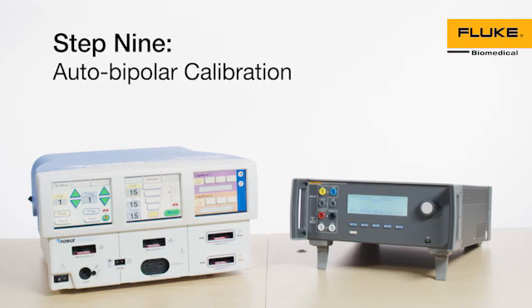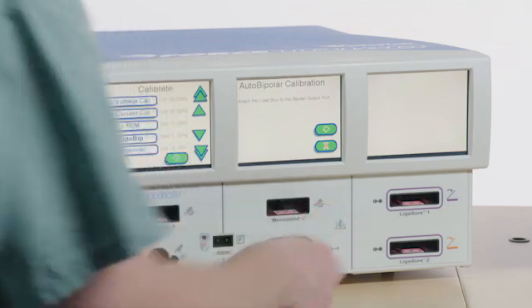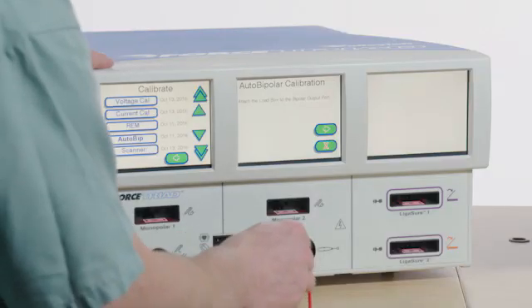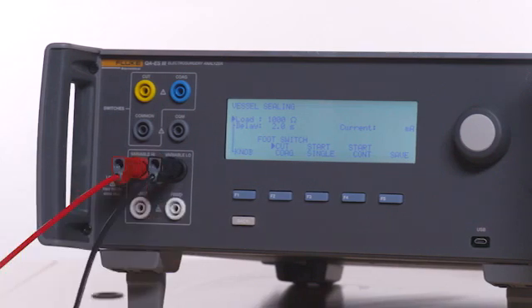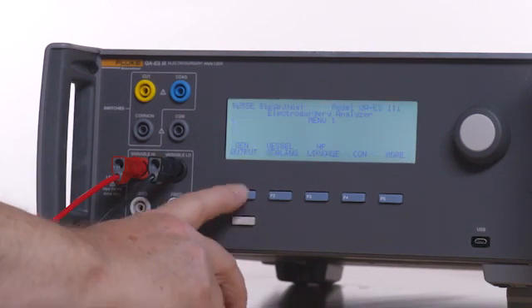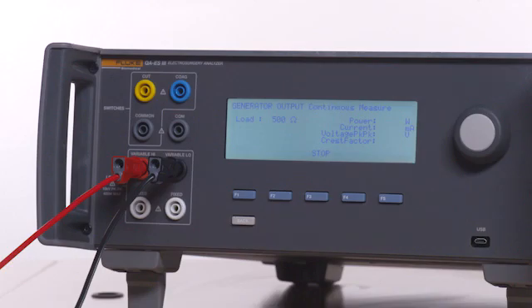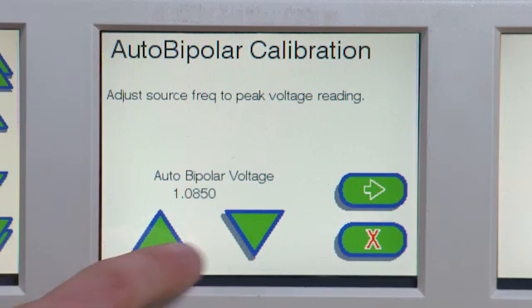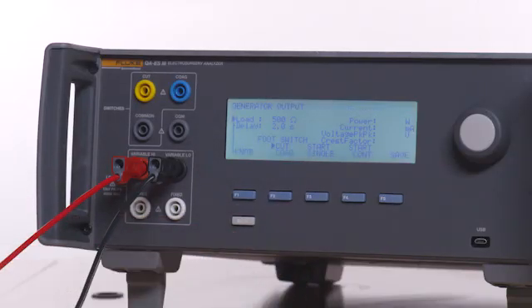Step 9: Auto-Bipolar Calibration. Select Auto-Bipolar from the Calibrate menu on the Force Triad. Connect a red test lead from either input jack of the Force Triad bipolar port to the variable high on the QAES-3. Connect a black test lead from the other bipolar input jack on the Force Triad to the variable low on the QAES-3. Press the back button on the QAES-3 and then F1 for generator output. Select 500 ohm load. Press F4 for start continuous. Follow the on-screen instructions on the Force Triad to set peak voltage as displayed on the QAES-3. Press Next on the Force Triad when completed. Press F3 on the QAES-3 to stop the test.